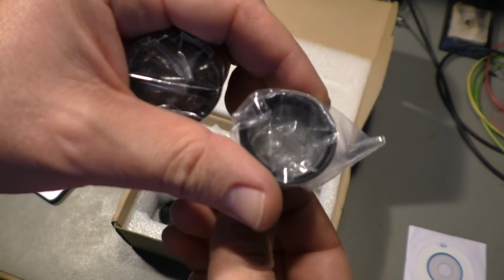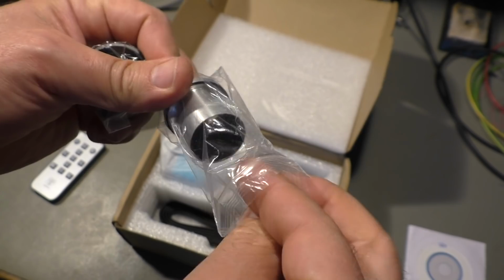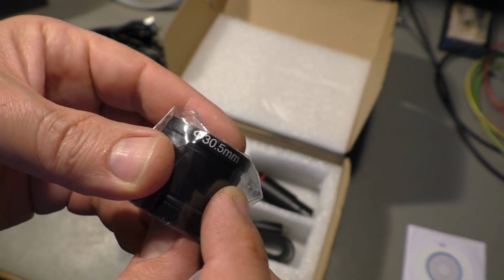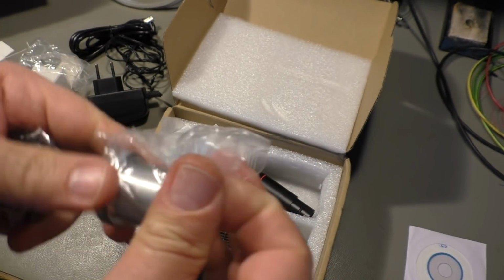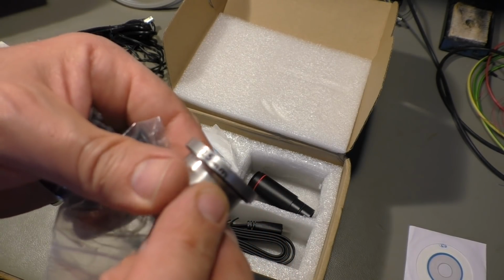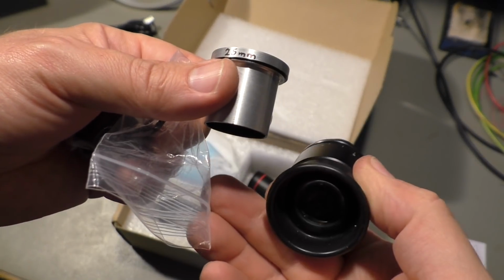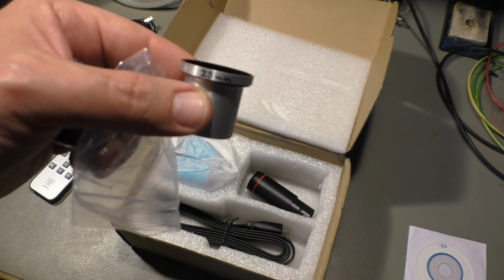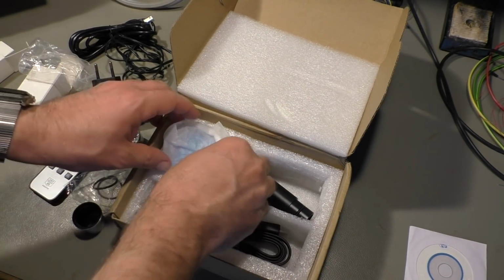And I already changed that adapter to a different size. So normally we have 30.5 millimeters, that's this size here, and that one was 30 millimeters, but now it's 25 because that's the size of the eyepieces of my microscope. And now you know where that camera goes.